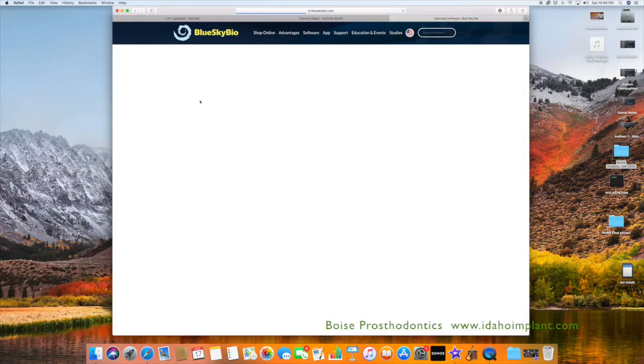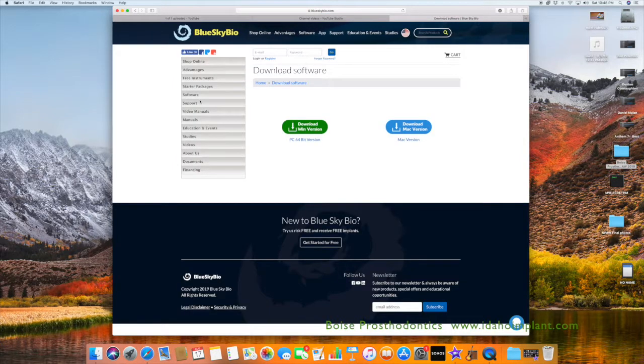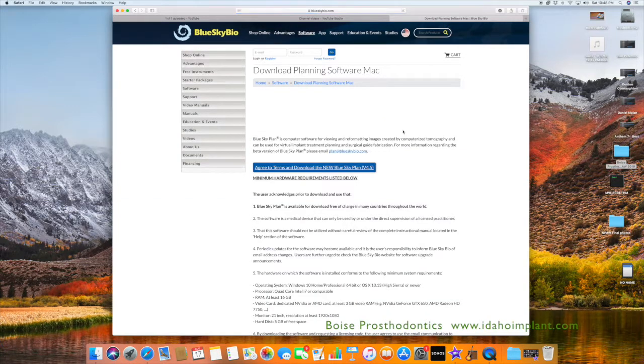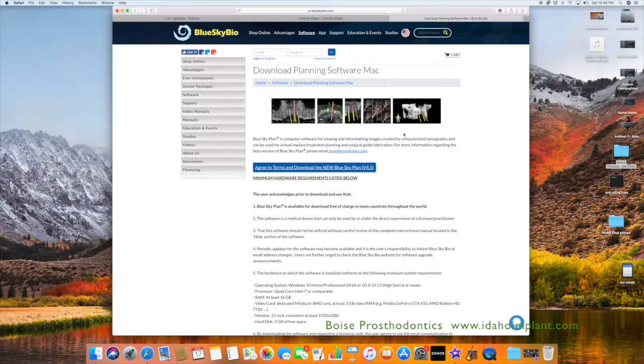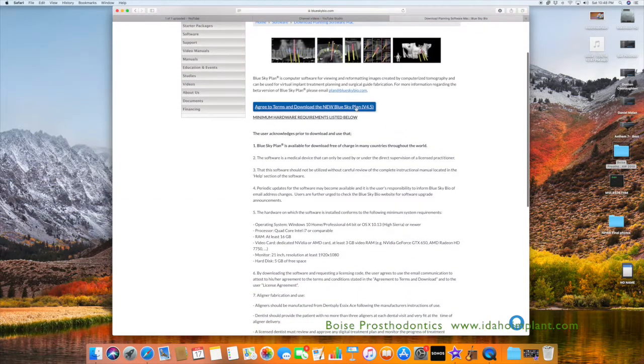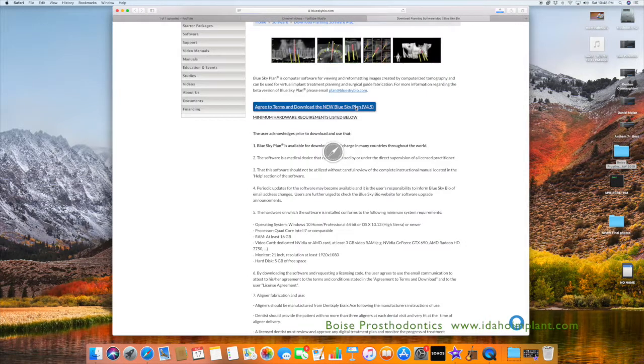You will then need to choose if you're going to download a version compatible with Mac or Windows. In this case, it is a Mac. Once you open that screen, you have to agree to the terms and download the new BlueSkyBio software.